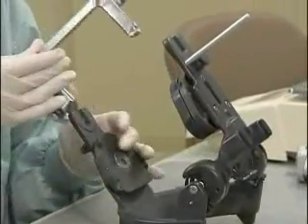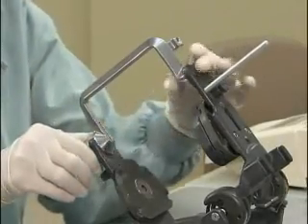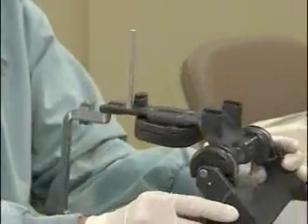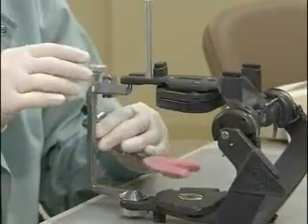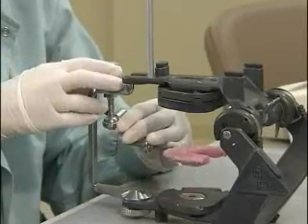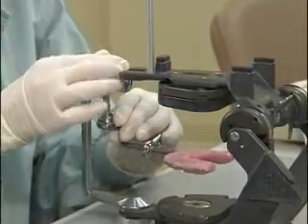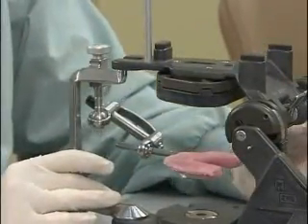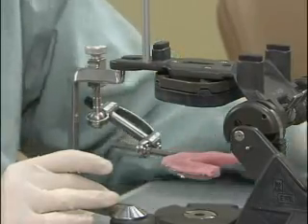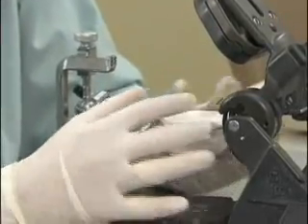Place the bite fork transfer jig on the articulator. Attach the bite fork assembly to the transfer jig, or in the event that you don't have a transfer jig, attach the entire face bow assembly with the bite fork attached to it to the articulator. Place the maxillary cast on the bite fork. Be sure to check that the maxillary cast does not rock.